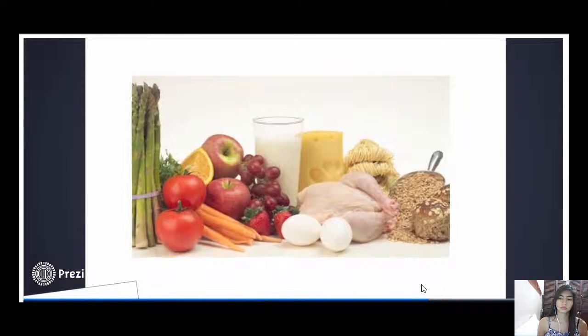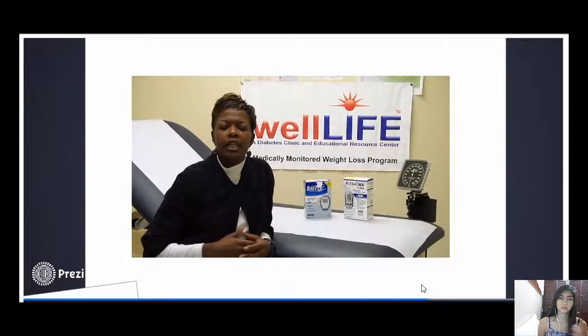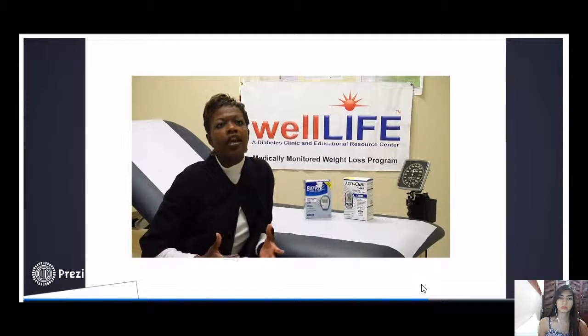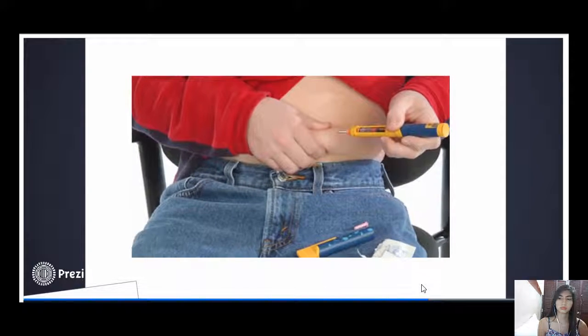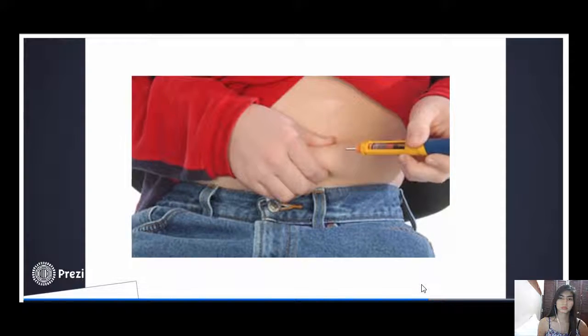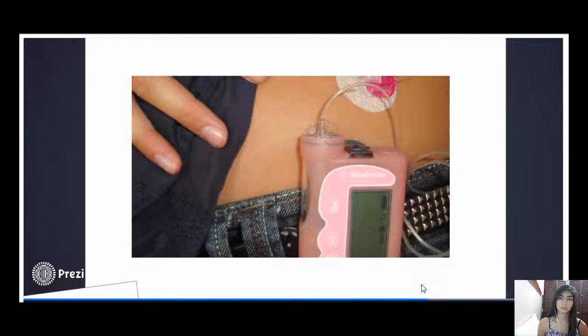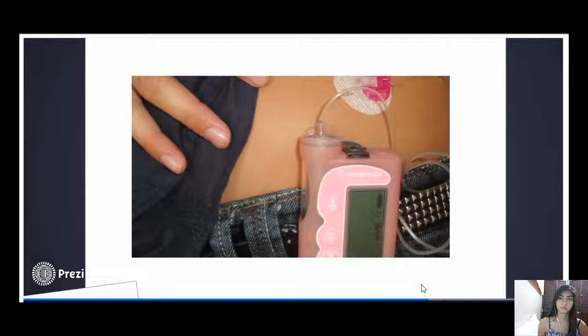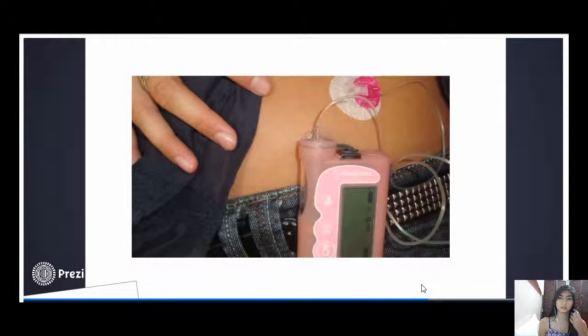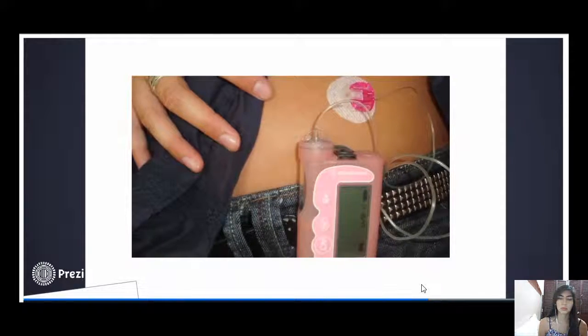One way that we have really engaged our type 1 diabetics, and I will say our type 2 diabetics, is with the insulin pump. Insulin pump therapy has allowed diabetics to truly live a normal and a healthy life because they are able to manage their blood sugars a lot better without giving themselves manual insulin shots. The pump works by infusion of insulin over 24 hours. So it starts from midnight to midnight. And the patient gets a slow release of insulin, which we call the basal insulin.